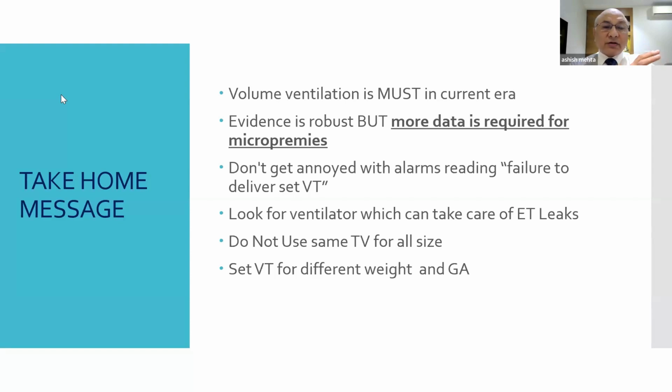Forget about the numbers, forget the screen. Ultimately, it's a baby, and our clinical examination is more important. Look at the chest expansion. Look at how the baby is being ventilated or not. Is the baby pink and well perfused or not? Is the mood stable or not? At times, because of the small tube size, blocked tubes, all these things, numbers will not tell you. Your clinical examination or clinical acumen will tell you where things are right or wrong.